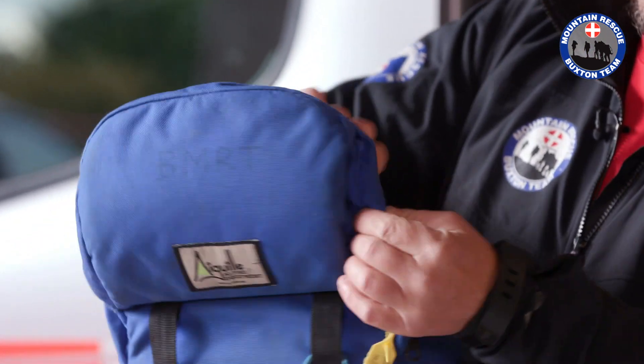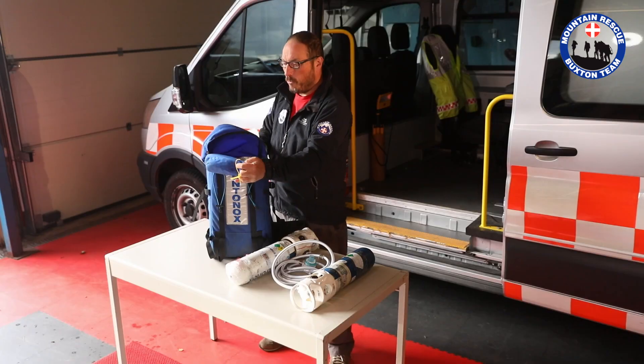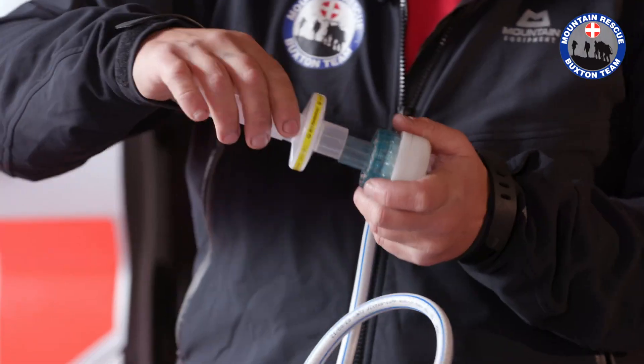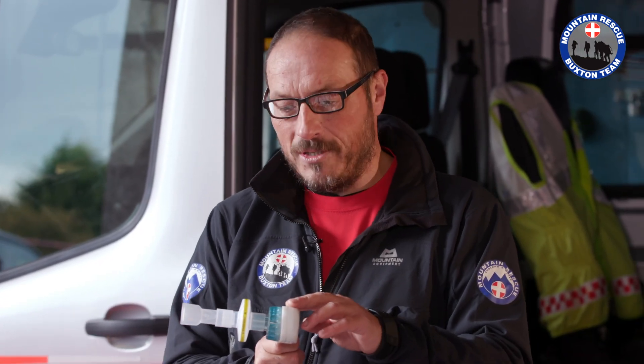Also, and you may have seen these — especially some of you ladies that have given birth — very similar to the gas and air that we have in hospital. There's a mouthpiece that fits on here. That pushes on very simply and we have a mouthpiece for the casualty to bite on. This is a regulator, essentially the same regulator that you might find on scuba equipment.